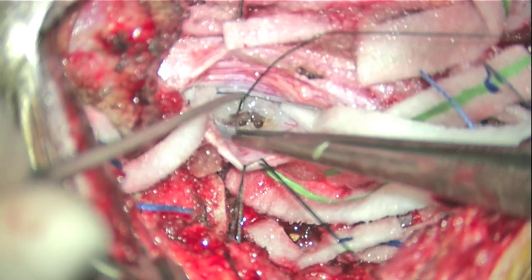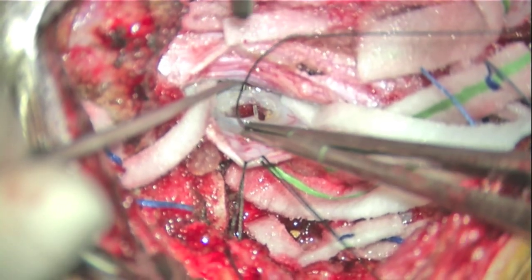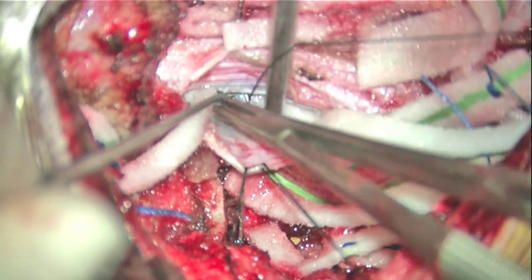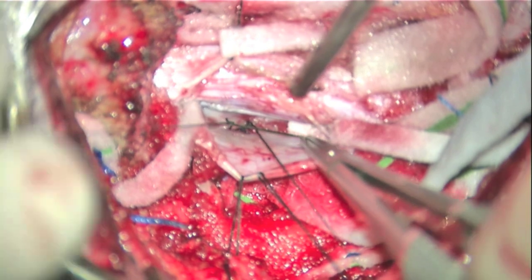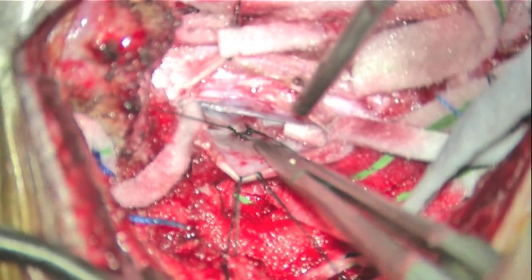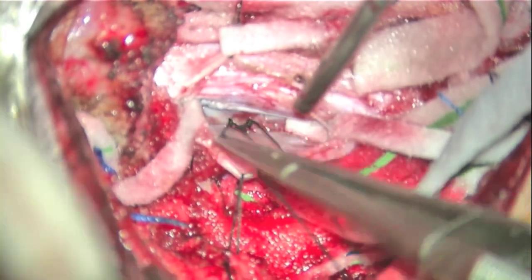I prefer to close the dural root sleeve opening first, since this is the most difficult closure to get watertight. The dura can be closed from the inside, as was done in this case, or the outside, but I prefer the inside technique, often with a small muscle pledget.